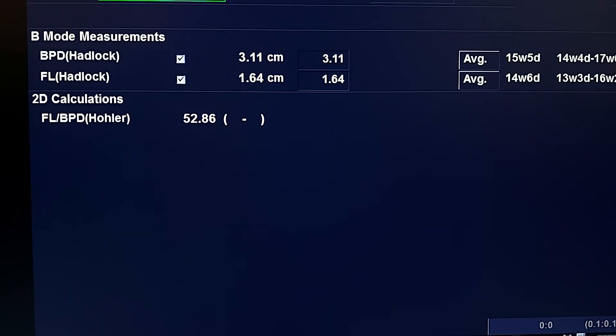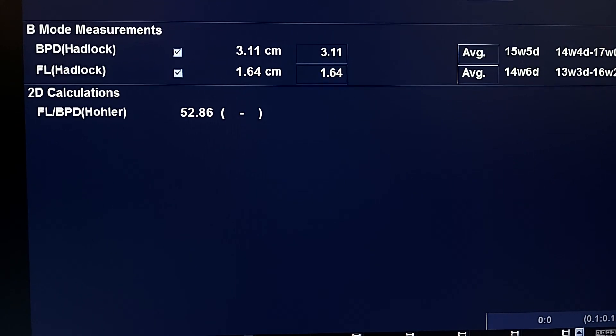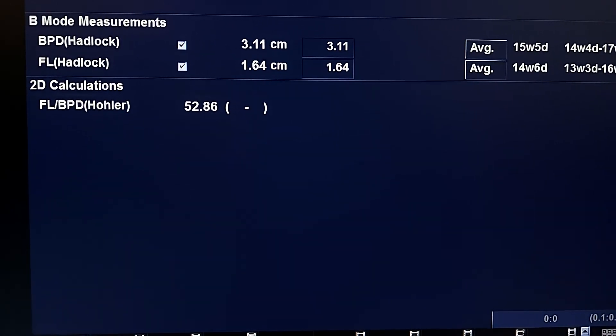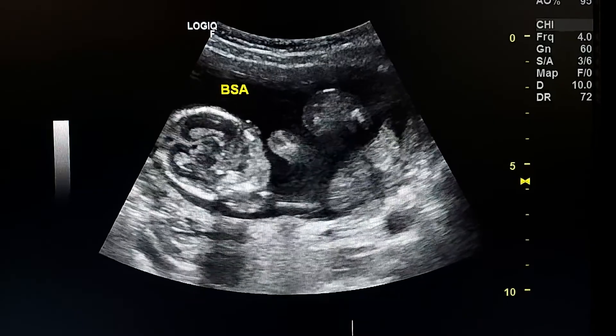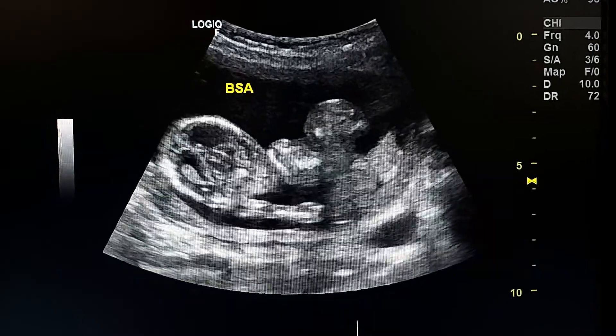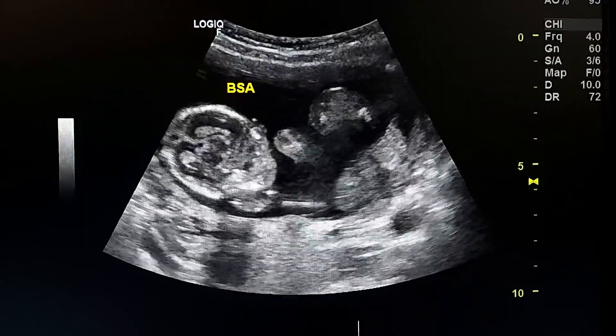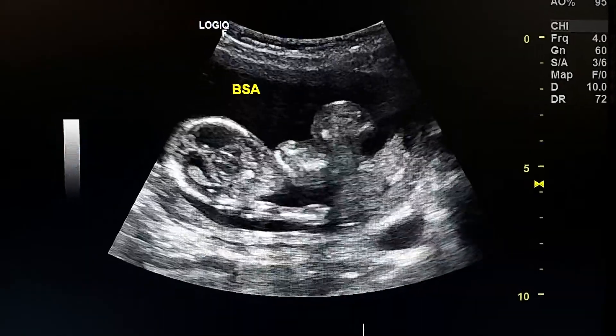The fetal age is roughly 15 weeks. Body stalk anomaly, BSA.